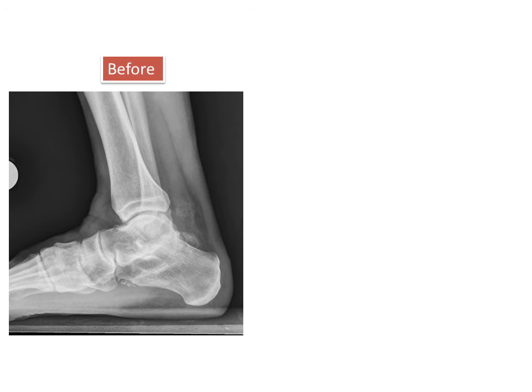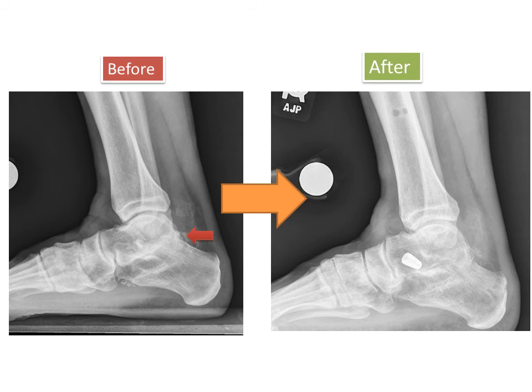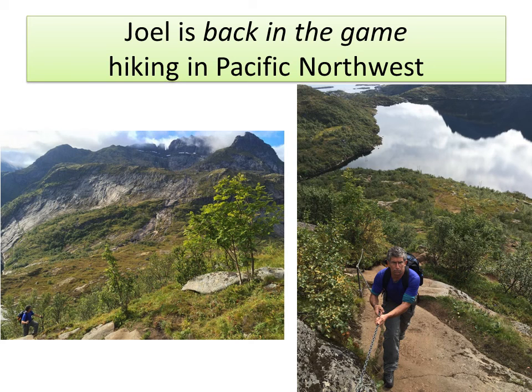A recap of Joel before, with joint space narrowing, subchondral sclerosis and increased density, and afterward you can see an improvement in the joint space as well as the density of the subchondral bone. Joel has gotten back to his active lifestyle and is without pain.